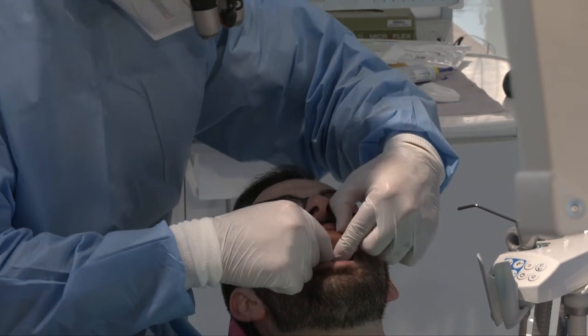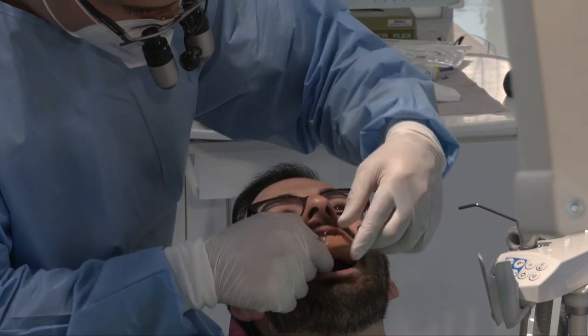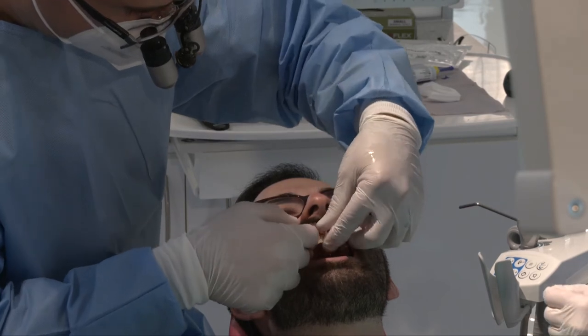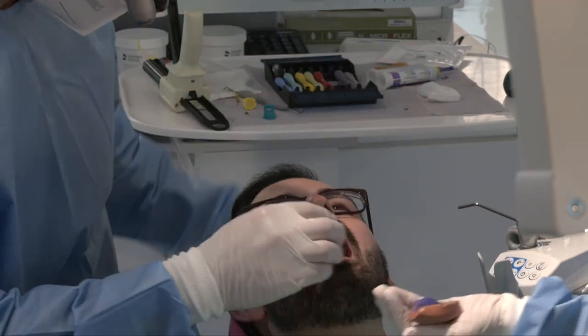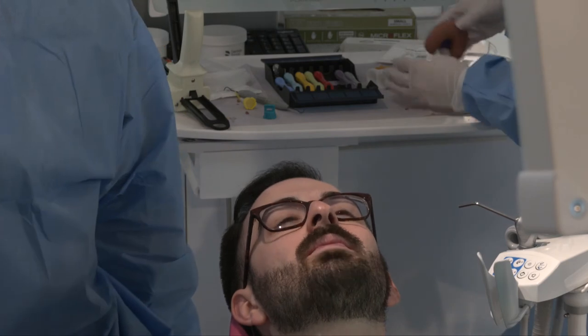So we're going to pop this off, and we're going to do some close-ups of the unaltered, untouched smile design. Okay, so a little bit of flash there just peels right off. And without taking a handpiece to this thing or an instrument, I'm going to show you what we get right out of the bat. So let's take a look.